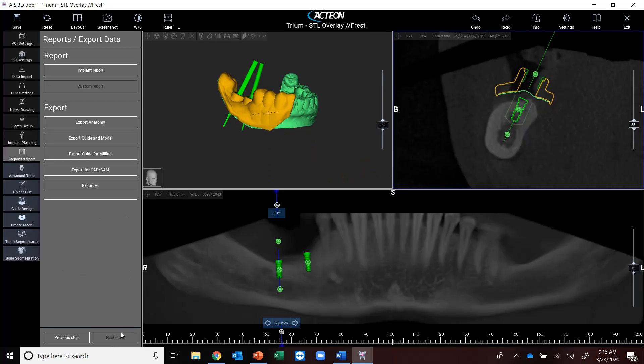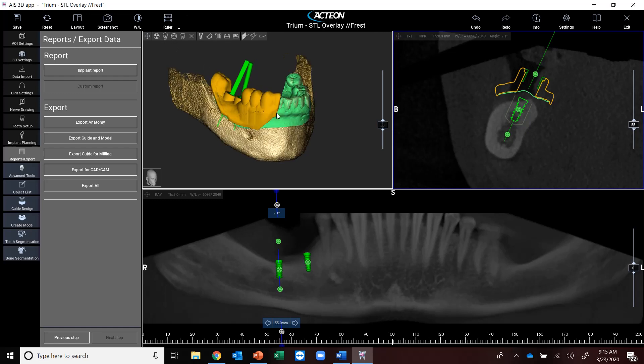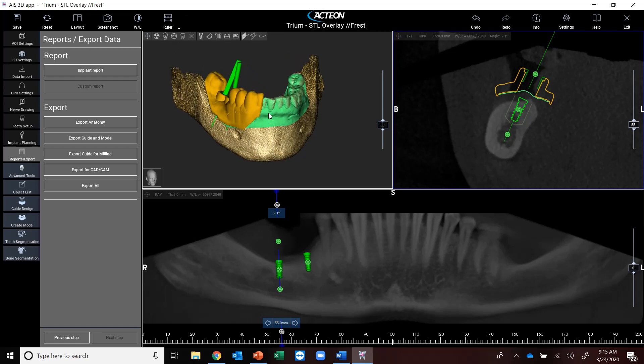And this is going to pop me back in to my exporting tab, where I can export the anatomy, export the guide for milling. This is all going to export into an STL file. This is extremely easy to use, guys.